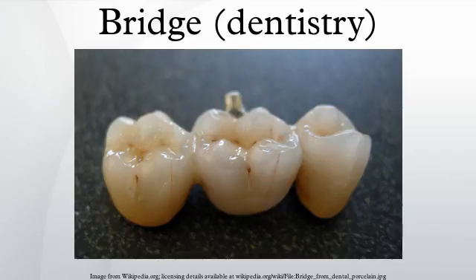When this is not possible, due to severe tipping of one or more of the abutments, for example, an attachment may be useful, as in the photo at right, so that one of the abutments may be cemented first, and the other abutment, attached to the pontic, can then be inserted, with an arm on the pontic slipping into a groove on the cemented crown to achieve a span across the edentulous area.